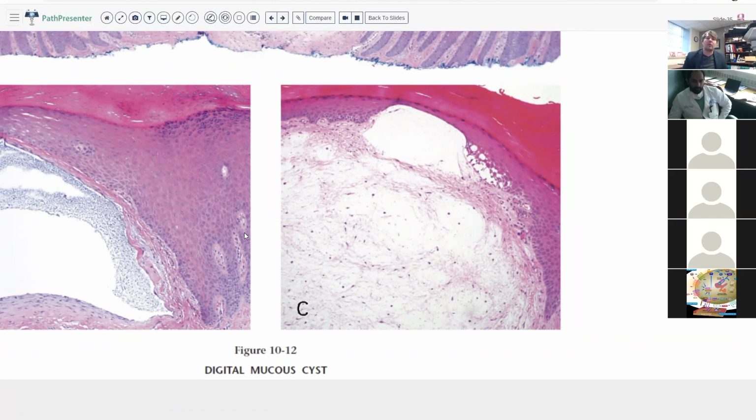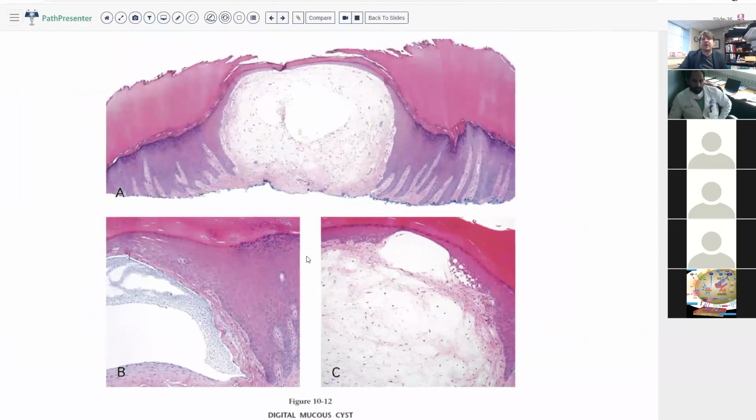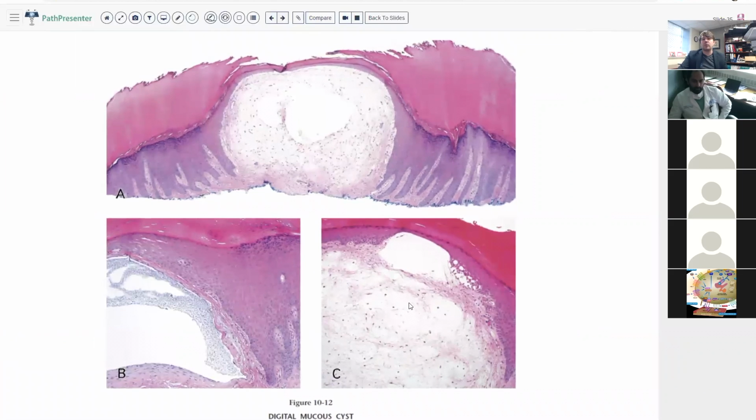So even if you're like, well, I don't see the cyst, that's okay. It can look like a little tiny myxoma. That's a totally common pattern. And to me, this is analogous to what you see in a ganglion cyst. And people debate over whether these are really ganglion cysts or if they're different, if this is actually mucin or synovial fluid that's seeped out of the joint space.